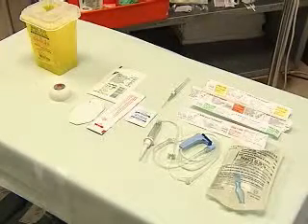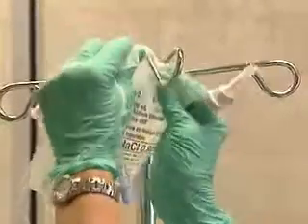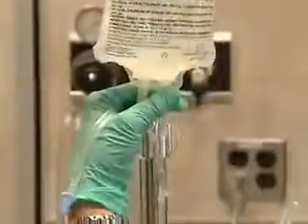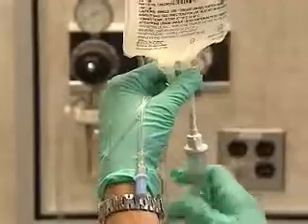It's quite simple to set up an intravenous line, but there are a few tips that can make the job easier. The intravenous fluid hangs at the bedside. Remove the protective cap on the sharp end of the tubing and insert it into the opening, being careful not to penetrate the side of the bag.